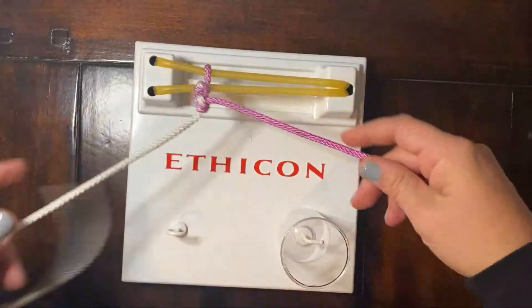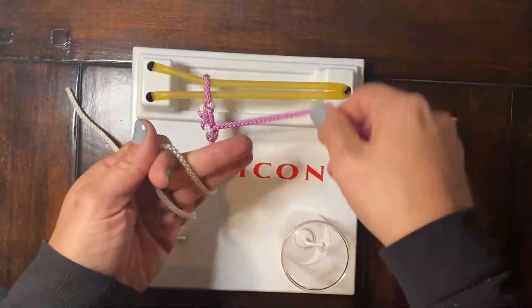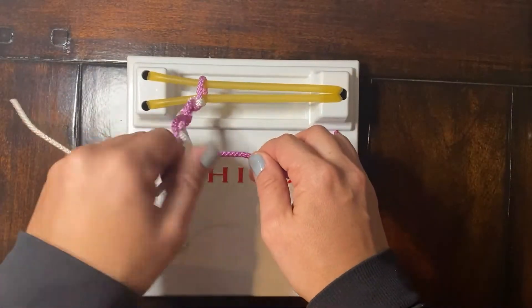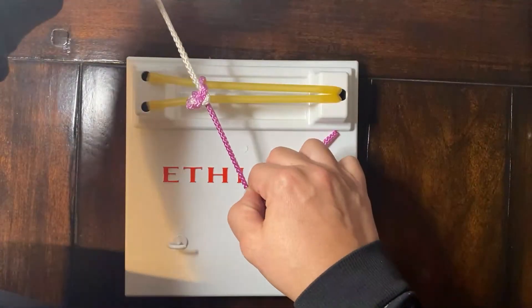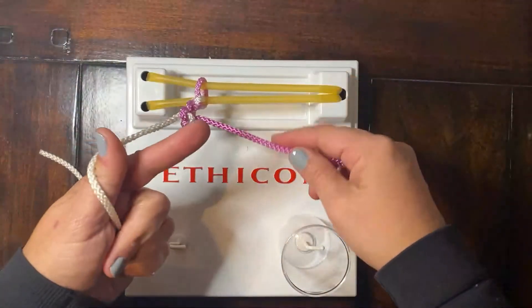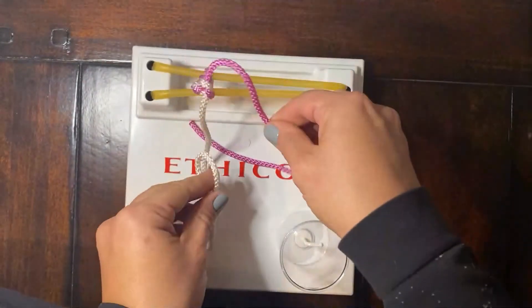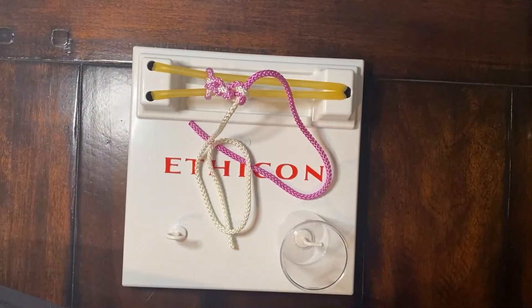So we're making square knots here with these two steps. First: pinch, chop, rotate — middle finger does the work. Second time: L, wrap — index finger does the work. Left-handed, one-hand knot tying technique.